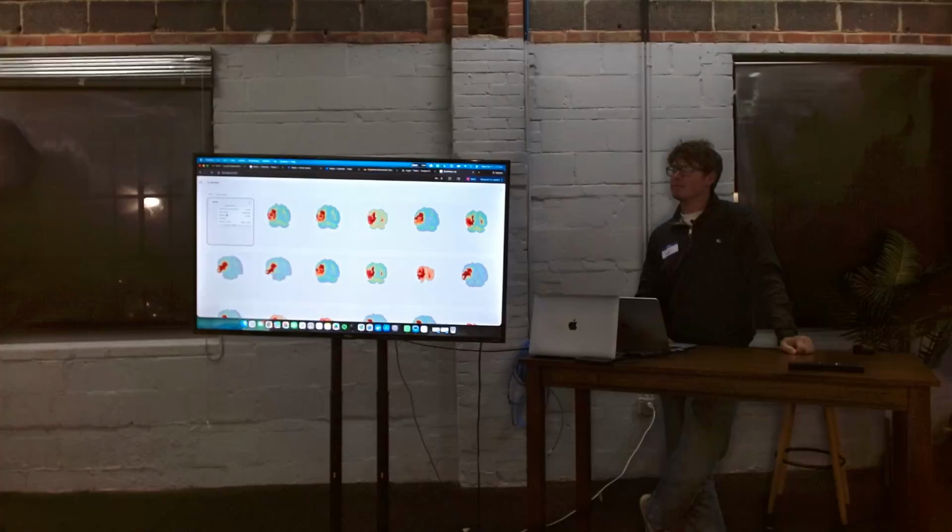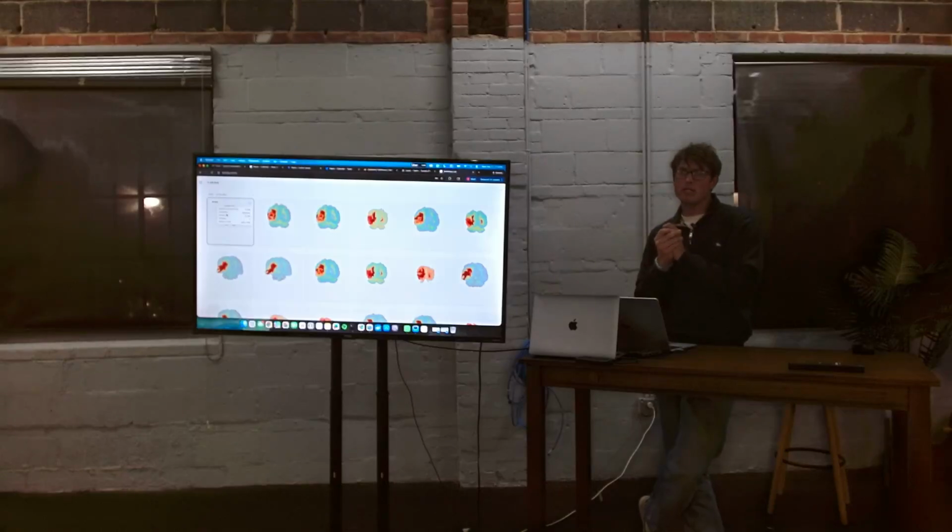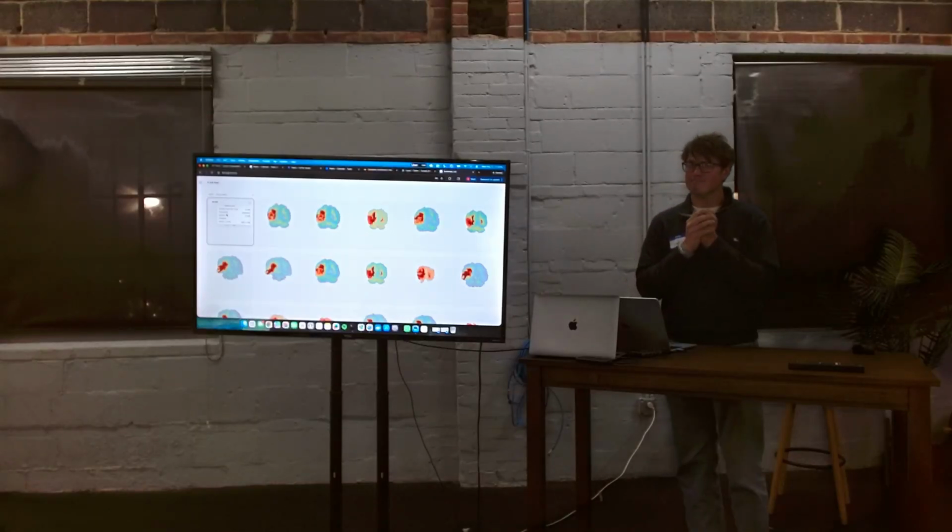Regarding the infrastructure, if this is running on your local machine, or you are using a GPU or a data center? So for the APIs, the SAM3 API and the Gaussian splatting, I am using Hugging Face. So I'm just deploying it through that. But for this, this is all just local, but because it's in React, I can host this online if I would want. I've noticed a lot of hospitals today are leaning towards a kind of server infrastructure, just a private URL that they can access.